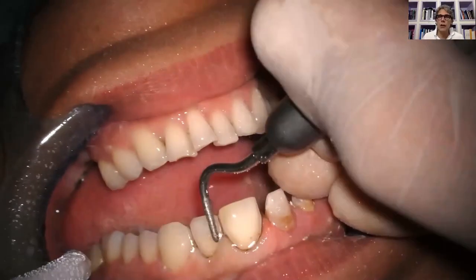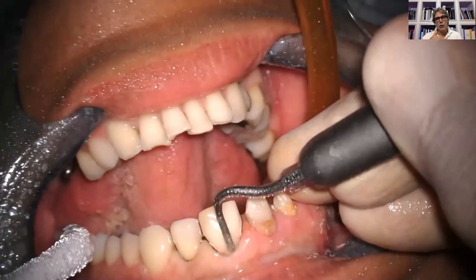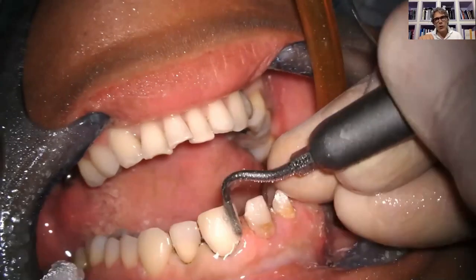Preparing subgingival is very, very dangerous. It's very dangerous because it will be very difficult for the scanner to digitally impress the finishing line preparation under the gum. After positioning the retraction cord, I can also finalize the preparation in the third cervical using an ultrasonic instrument or some hand instrument in order to better redefine the finishing line preparation. That is a very delicate area, and we have to treat it very carefully in order to obtain great precision and great accuracy of the restoration during the cementation step.